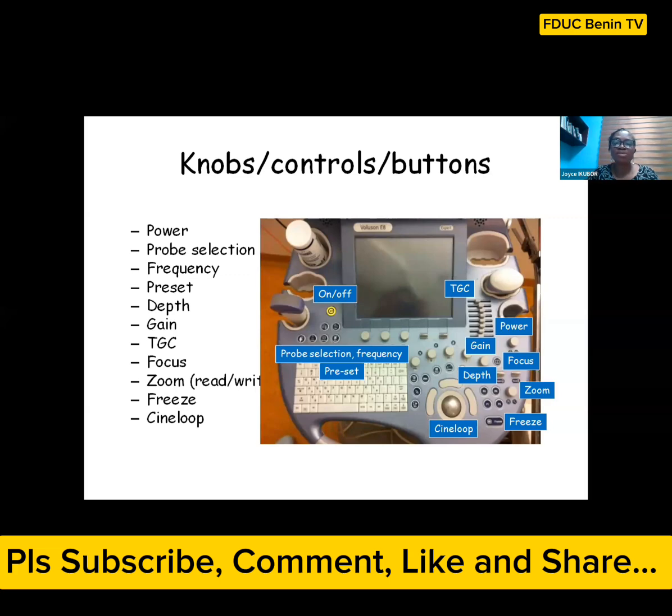There's a knob called the probe selector or selection. You select the probe based on the examination you want to do. So either you are selecting a high frequency probe or low frequency probe, depending on the examination. And for the purpose of our study, we are doing obstetrics ultrasound. We'll select the low frequency probe or transducer. Most of the machines also have a knob known as the preset, where you have to select it before you start. So you can click on it and then you select the exam you want to carry out. So these are all the knobs.